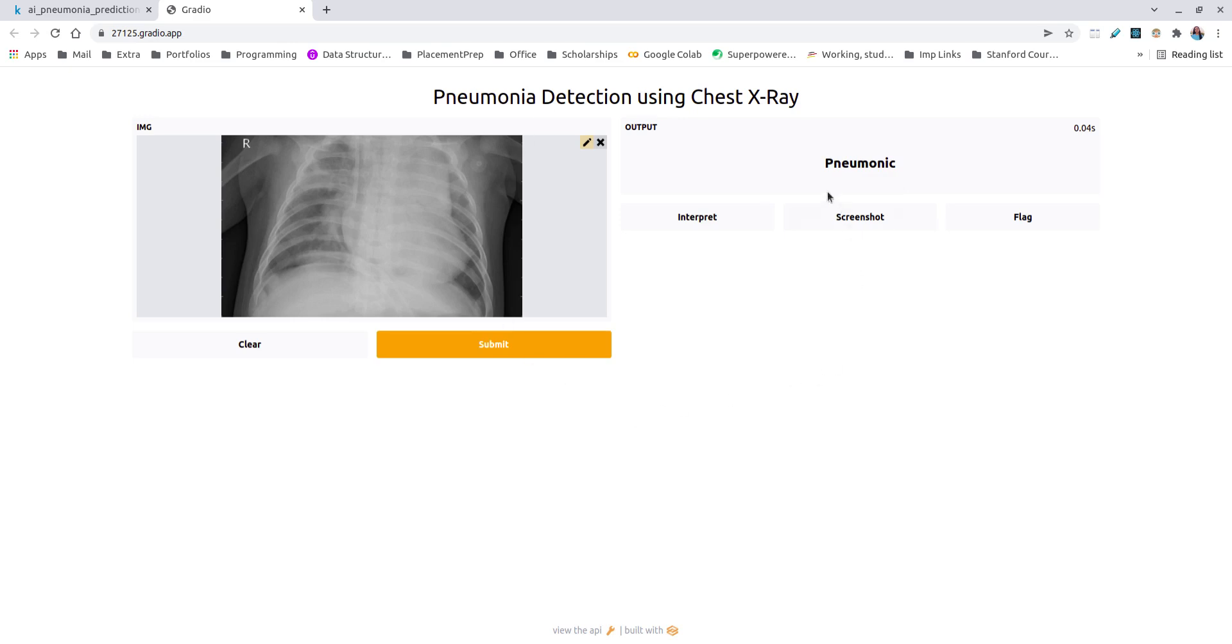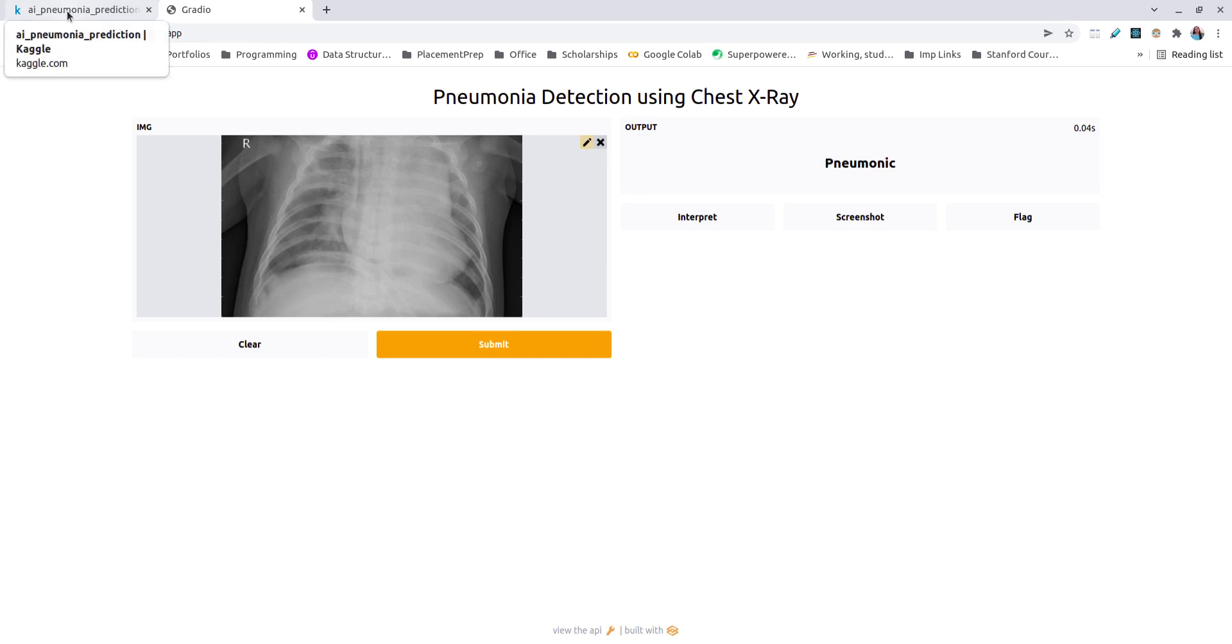This particular application can be very useful at the times where X-rays are fed into the systems and a detection is made whether the X-ray is of a normal person or a pneumonic person. Let us have a look at the implementation of my project.